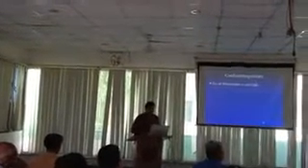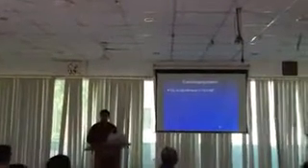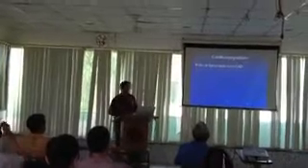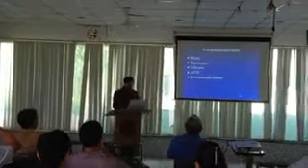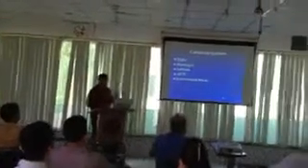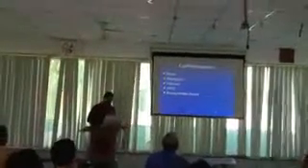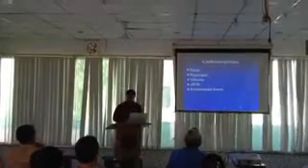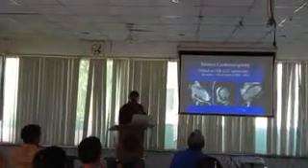So, now you see all non-ischemic cardiomyopathies. So, it is saying that all that enhances is not CAD, not necessarily. So, what are the various cardiomyopathies? We have dilated, hypertrophic, infiltrative, arrhythmogenic right ventricular cardiomyopathies, and endomyocardial diseases. So, we will see patterns in each of them.